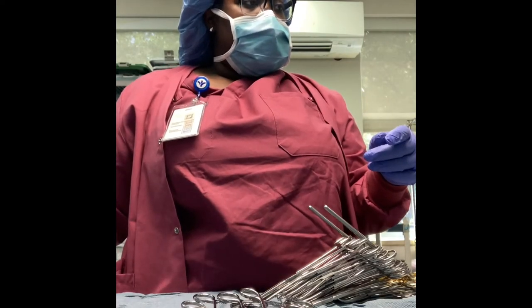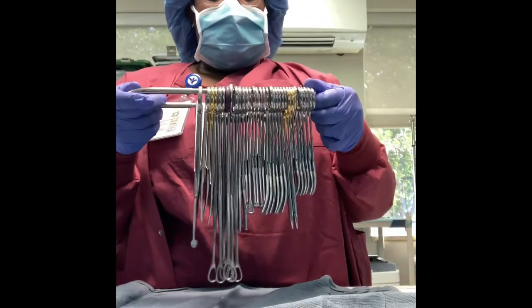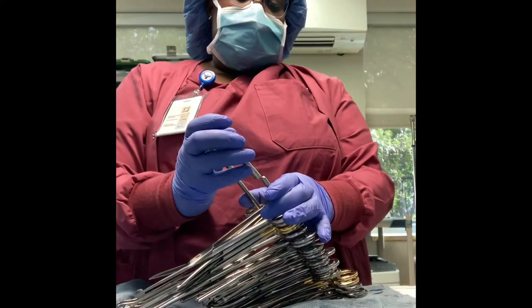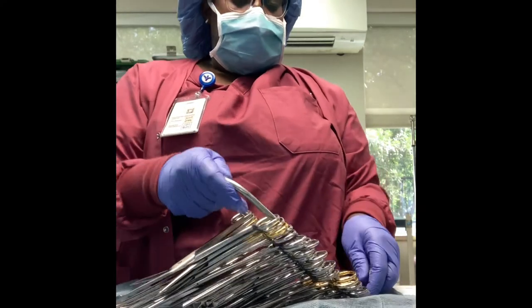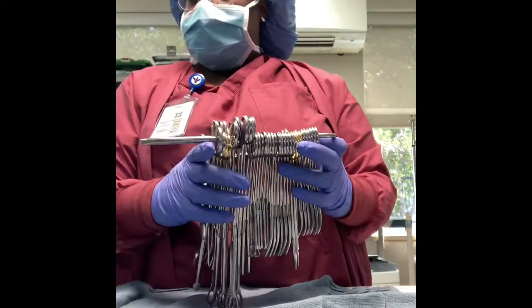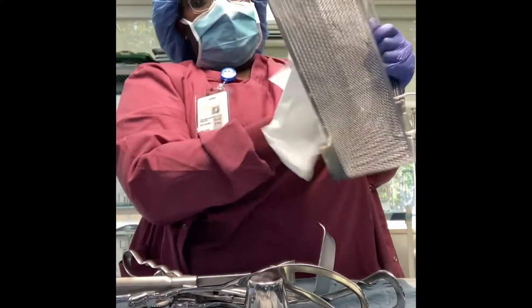We are finished with the stringer portion. Every time I do my scissors I like to hold it up because it makes sure that all the scissors are on the same rack — sometimes you can misplace a scissor on the rack and it will hang off. Now I'm basically just wiping out the tray since it was wet.